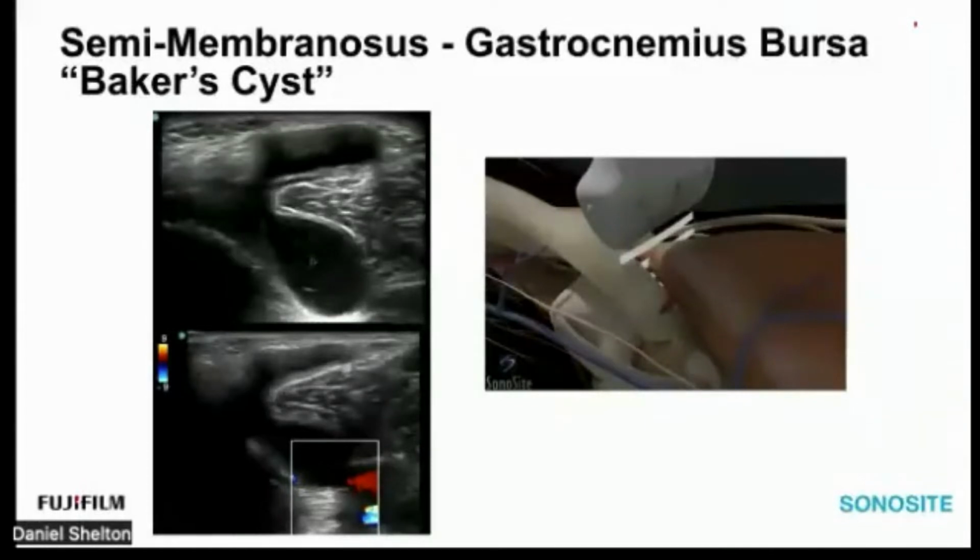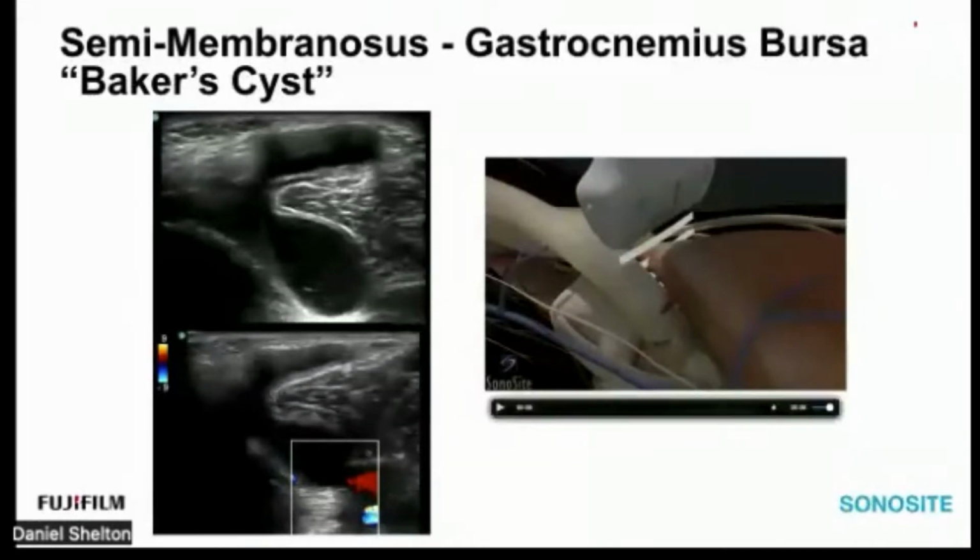But if it does not posteriorly enhance, and that's what we call this, even though they should just call it somehow that it's enhancing deep, because this would be the anterior part of the knee, for example. I don't like that we call it posterior acoustic enhancement, but it is acoustic enhancement deep to the hypoechoic cystic structure here. So if it is acoustically enhanced, you can usually aspirate it just fine. If it's not acoustically enhanced, it may have solidified into that frustrating gelatinous material that sometimes you get out of ganglion cysts.